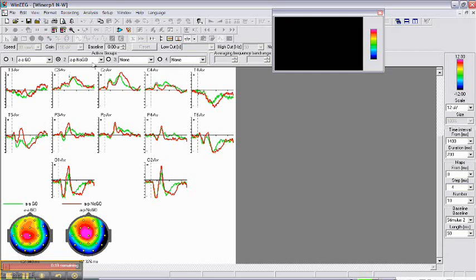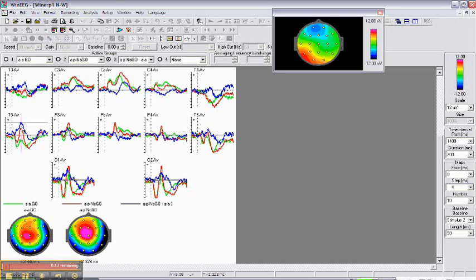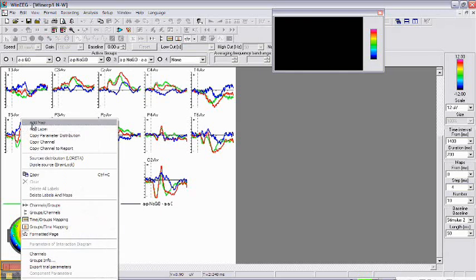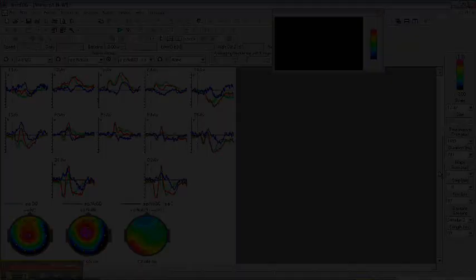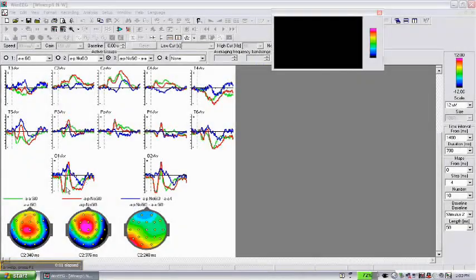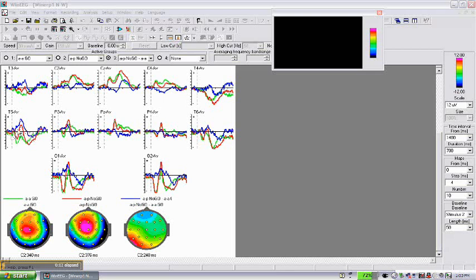We can also compute the difference between go and no-go condition and we can map the difference between go and no-go condition. So we computed ERP that we can see ERP after the second stimulus presentation. Green is go condition, red is no-go, blue is difference between go and no-go condition.